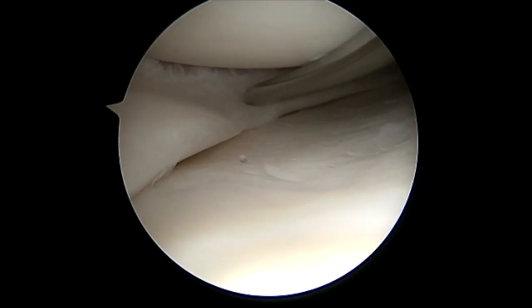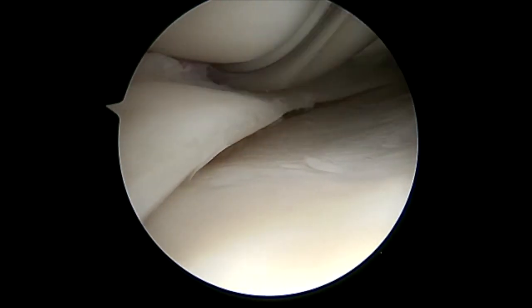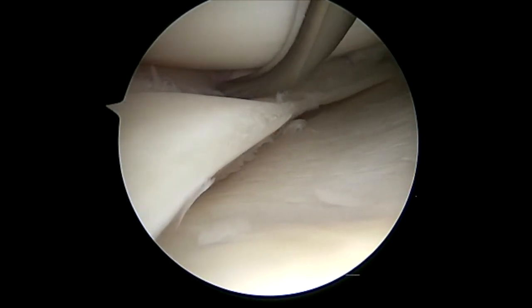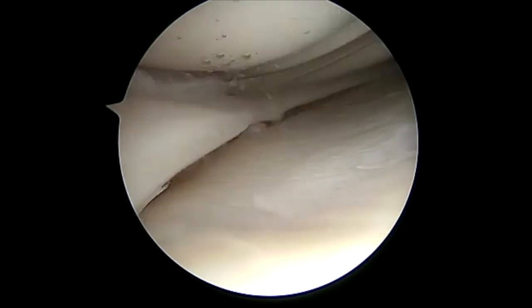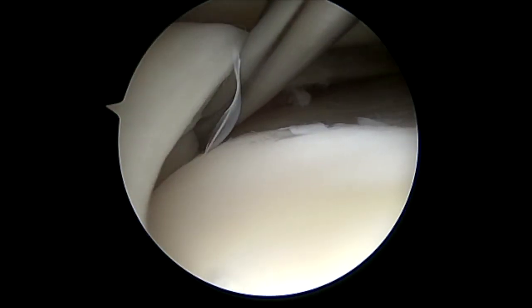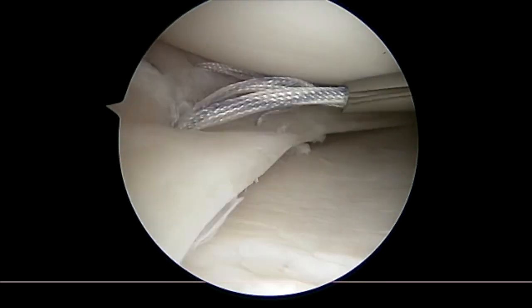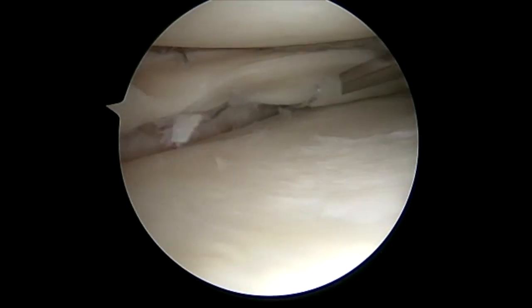Once the posterior portion is performed, we focus attention on the mid-body, making sure we have a good bite of the meniscus below, then enter into the capsule. Another trick is that whoever is retrieving can snap the ends together in order — this makes tying at the end much less difficult and avoids any tangles. All of this is used through the same guided system with no need to switch cannula types, and we're able to get all the way up to the anterior horn.